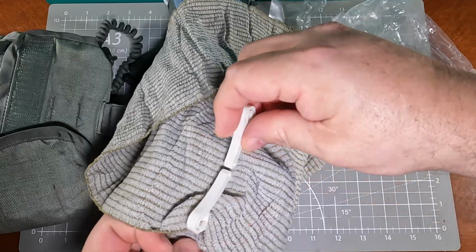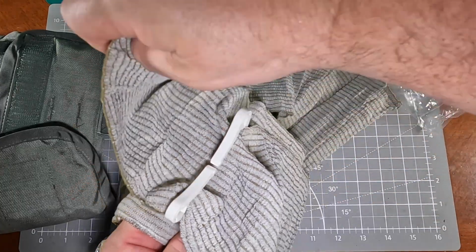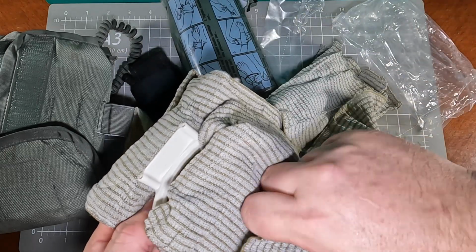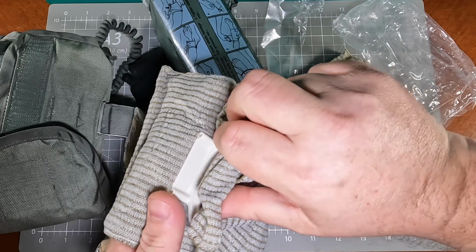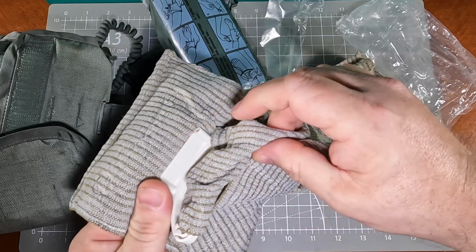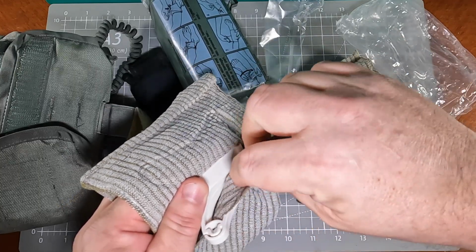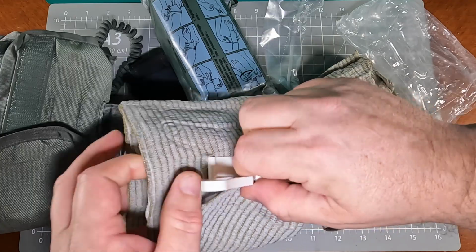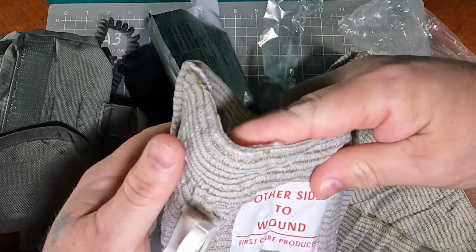And what this little pressure bar right here does is it allows you, once you get it so tight, if you want to come back around on it and go in the opposite direction, it pushes it down and allows pressure. And on the same token, if you need to twist it and make it tighter, you can use this as kind of like an improvised tourniquet, although a regular tourniquet is normally preferred. But the little Israeli dressing is a game changer.